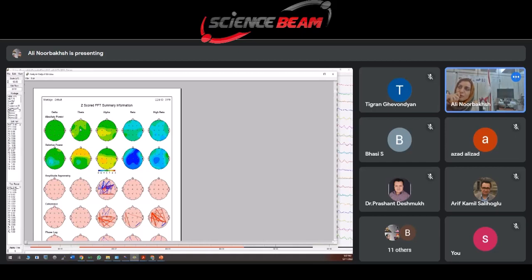Which part increases the theta? Do you know? Frontal? Yes, frontal. Theta increases in the frontal.